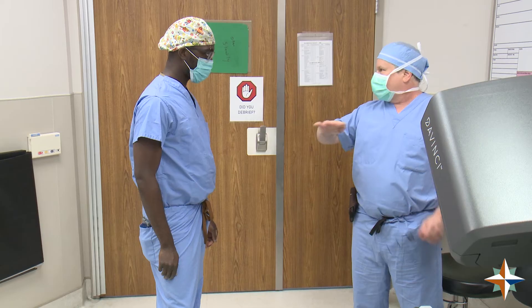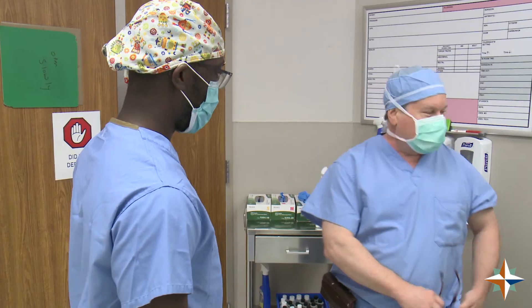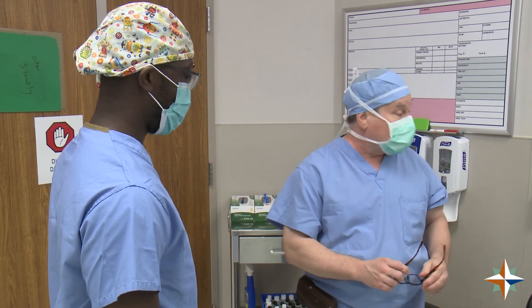The obvious advantage is that I do most of my operations in the abdomen, so this is where I'm most familiar with, and Dr. Taylor works in the chest. You bring two surgeons with the utmost expertise and combine that to essentially make the procedure seamless and better.